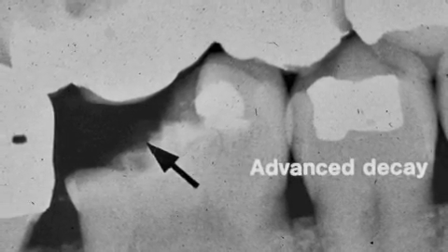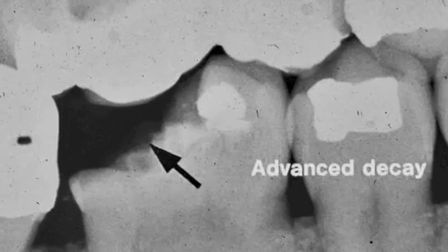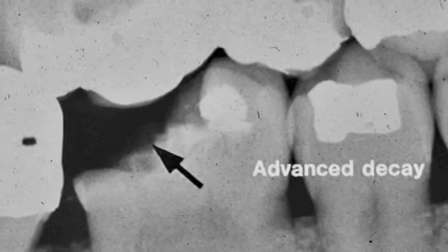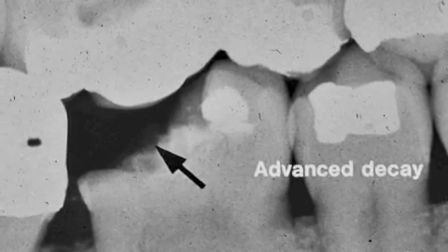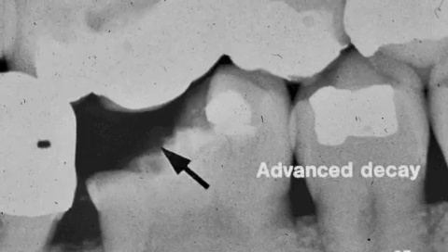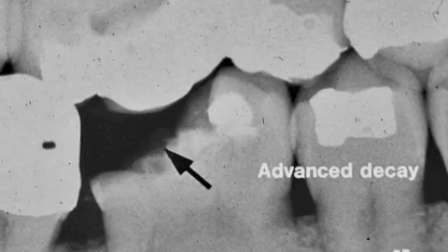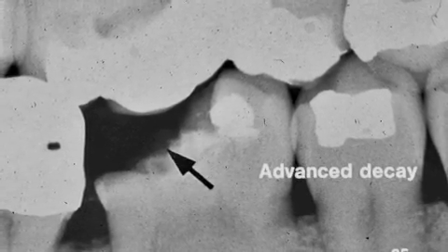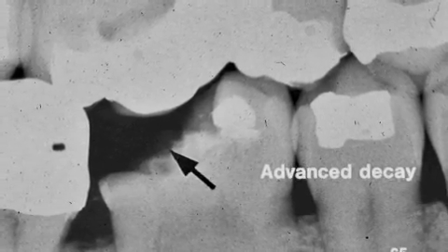This is tooth number 30. We have advanced decay more than halfway into the dentin. It is a C4 caries classification on radiographs.